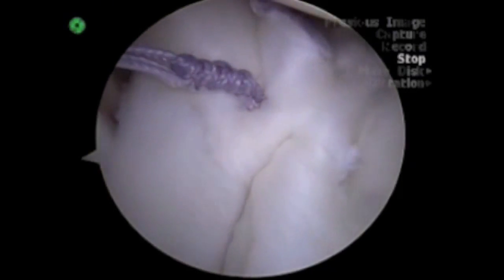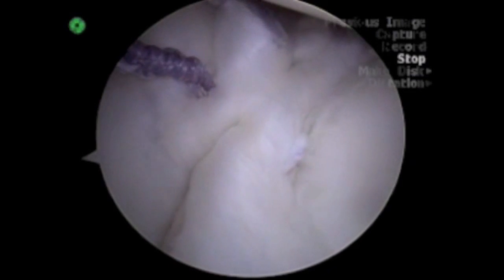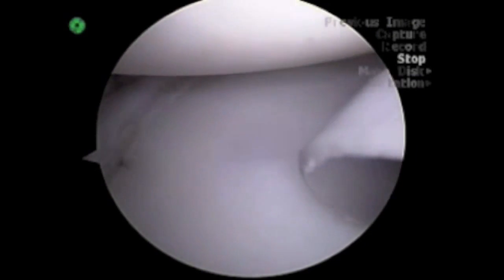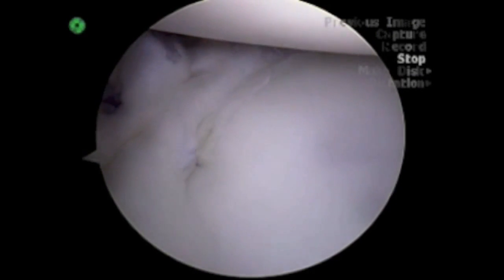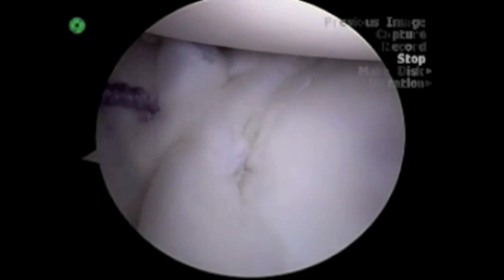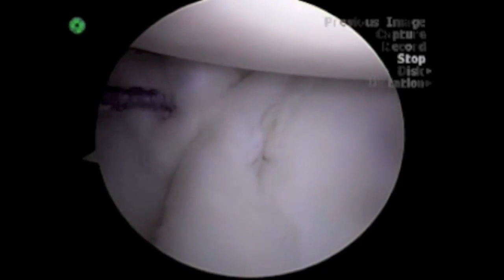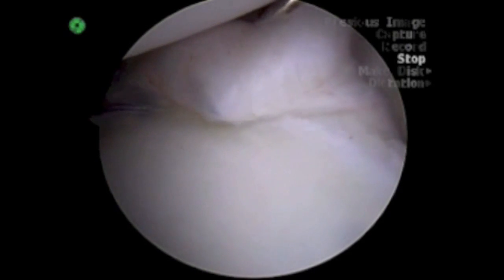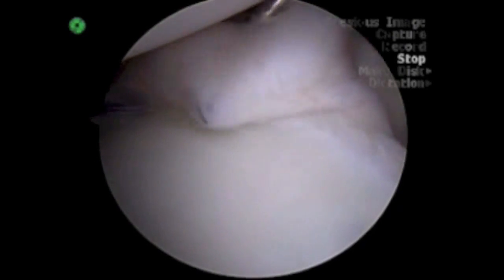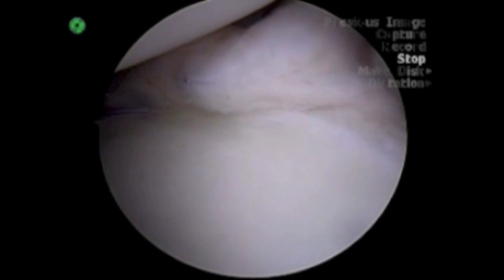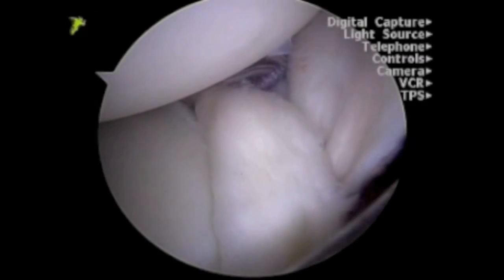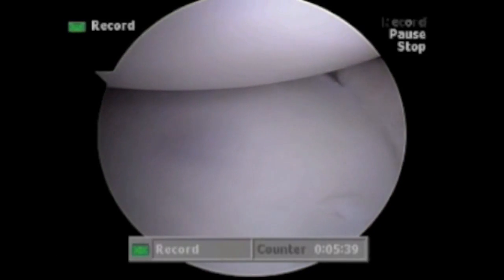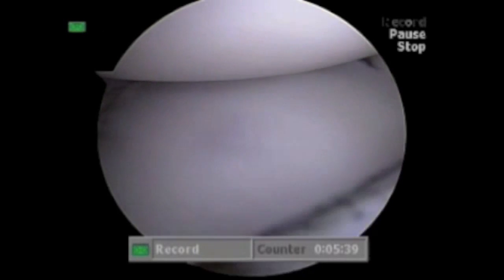Here we demonstrate the reinforced inferior labrum buttress, which is stable to manual stress. Anterior instability, which was the next most prominent finding on the examination under anesthesia, is addressed with the same technique. The suture can be placed both anteriorly and posteriorly to balance the capsule.